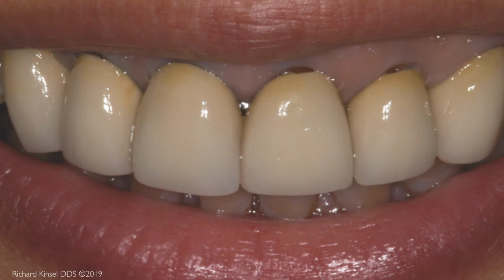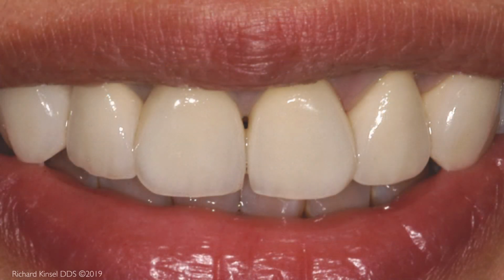This patient has 6 old porcelain metal crowns that need replacement. Note the dark roots and the gray metal of the crowns. The final all porcelain crowns mimic the color, vitality, and brightness of her natural teeth. The darkness of the roots has been masked.